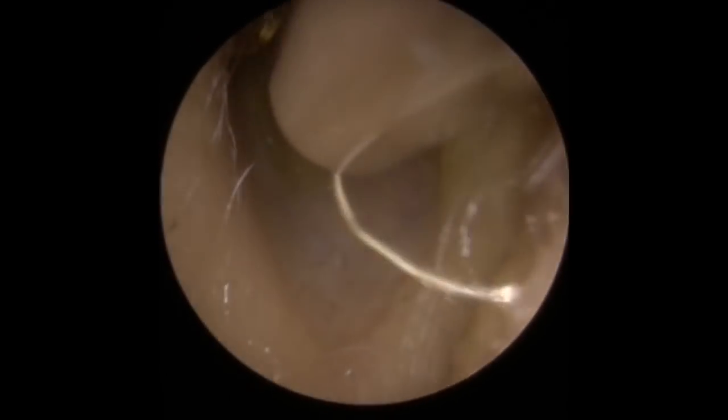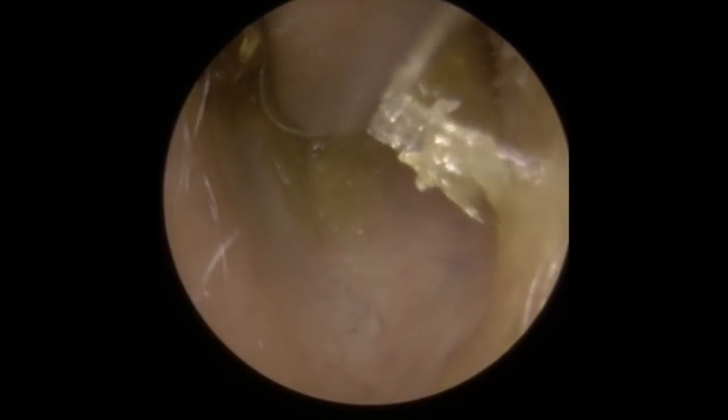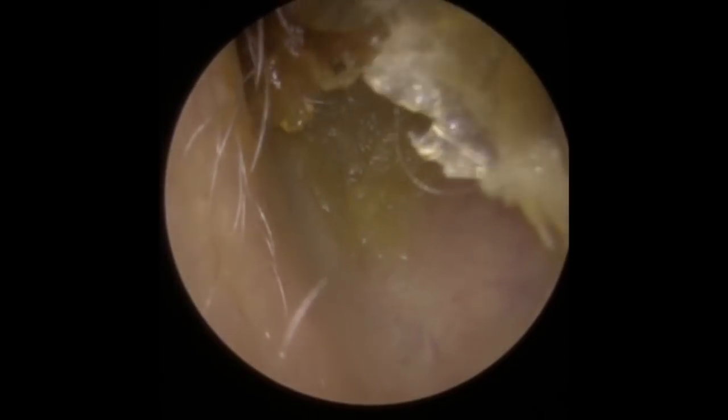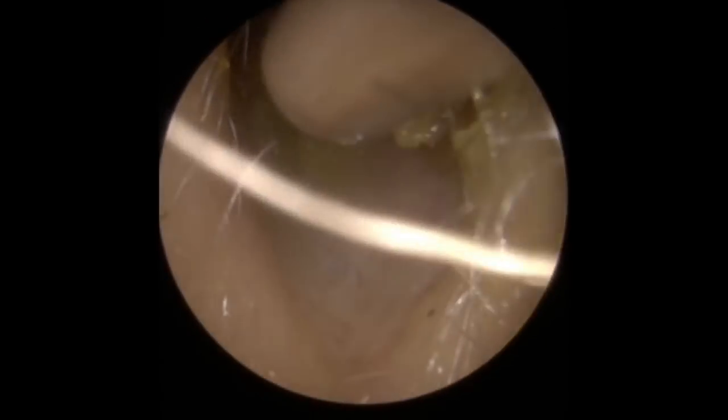This first patient has come through with a lot of reduced hearing — no pain or anything. But what we can see here is quite a large blockage of earwax deep in the canal, roughly about half way down the front end of this wax. So just very gently stripping this wax out with a standard size Zollner tube here.